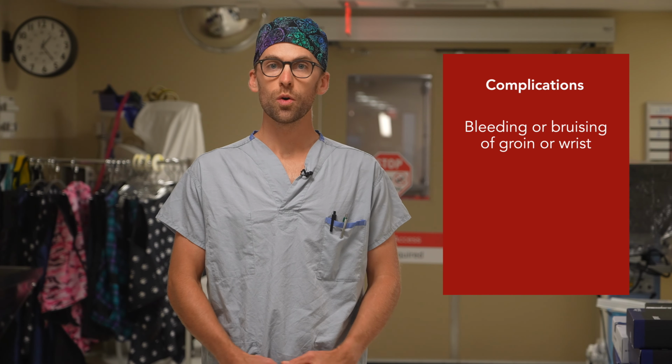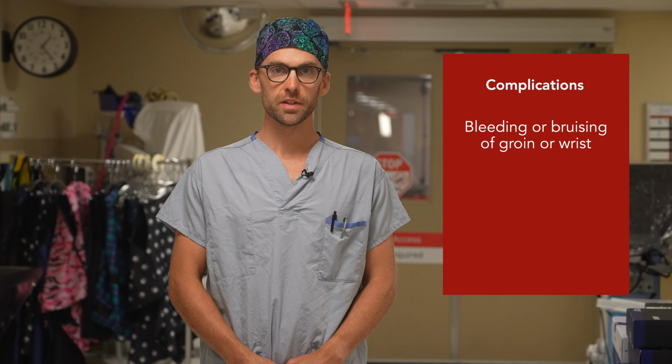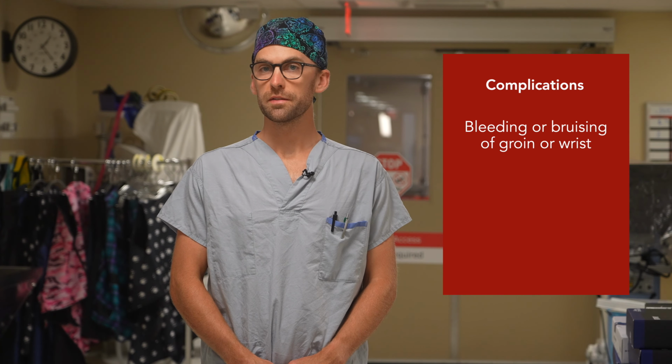Like many medical procedures, an angiogram does come with several complication risks. You have been ordered this procedure as it is felt that the procedure's benefit outweighs the risk. However, it is important to understand the potential complications prior to giving informed consent. The most frequently experienced complication is bleeding or bruising of the groin or wrist. Although this can potentially be dangerous, the need for a blood transfusion is very rare.